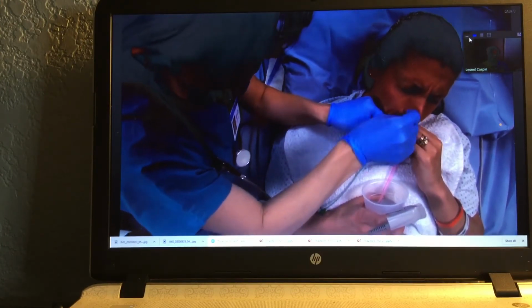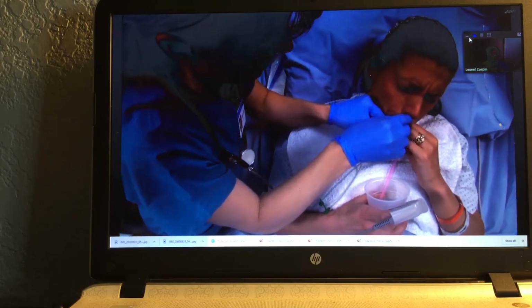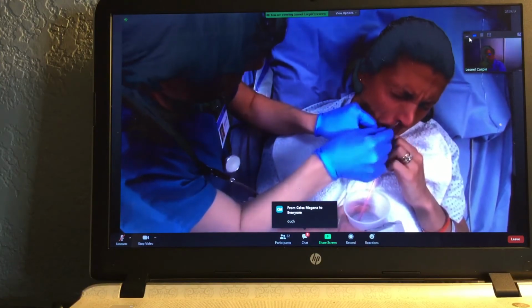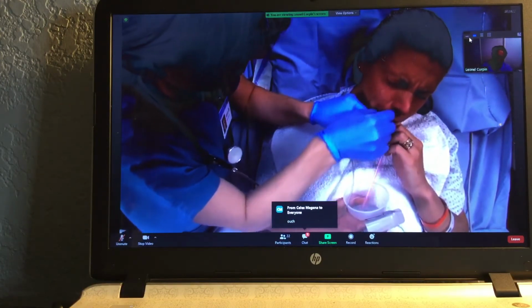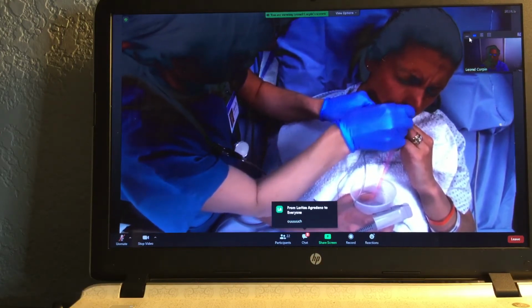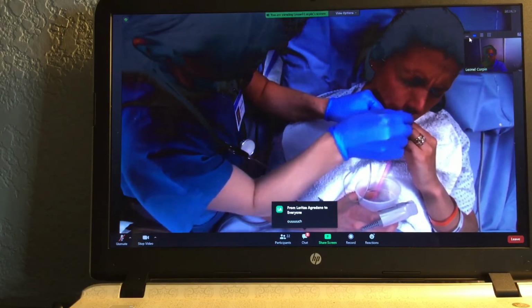You can also rotate the tube 180 degrees while inserting it to facilitate its passage and prevent friction-induced damage to the mucosa membranes. Advance the tube each time your client swallows until you insert the predetermined length.